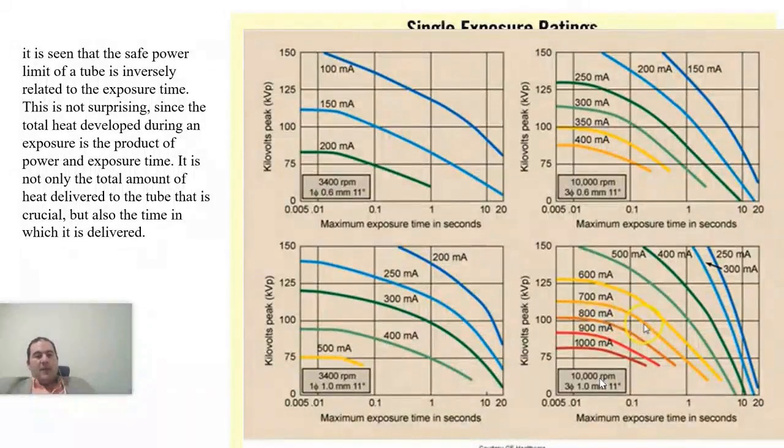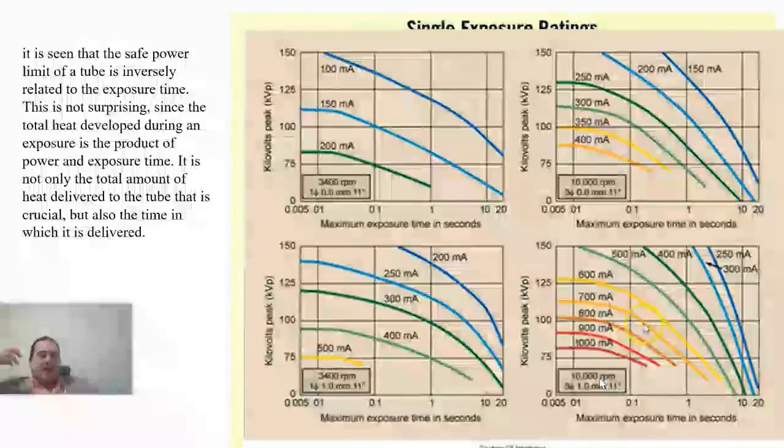So increasing the parameter will definitely enhance the efficiency. It's good for cooling, and it will increase the efficiency. This is sure. But as someone working on the machine, what matters to you is the application you want.